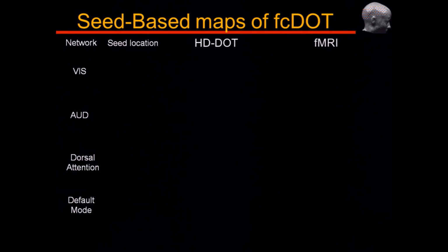Some people may be familiar with this, but it turns out, of course, that you don't have to ask the brain to do things for it to be doing something. It's always doing something. And so you can map the brain by just looking at its resting state fluctuations, by looking at correlated structures in those time series movies. And so here are some results from that.